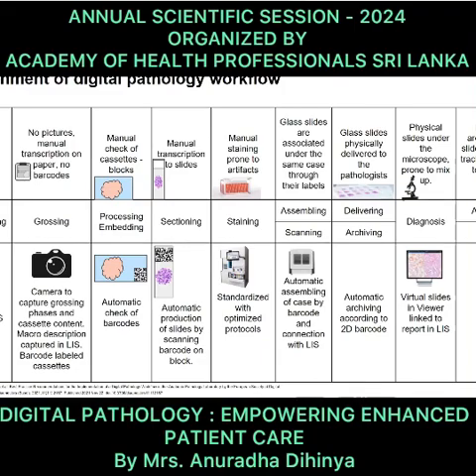When I'm talking about the histopathology workflow getting digitalized, there are sample tracking systems available in the histopathology area, which are now gaining the market with the help of the digital scanner. When I'm talking about the sample tracking involved with the digital pathology workflow, what it does is track the complete system from your sample receiving to your submission of the report, where every specimen and every block that has been prepared would be barcoded and tracked.